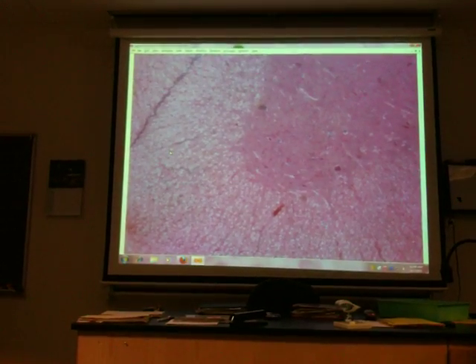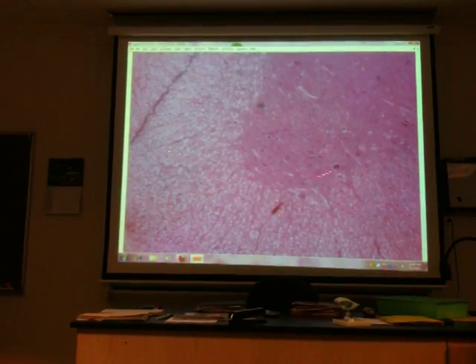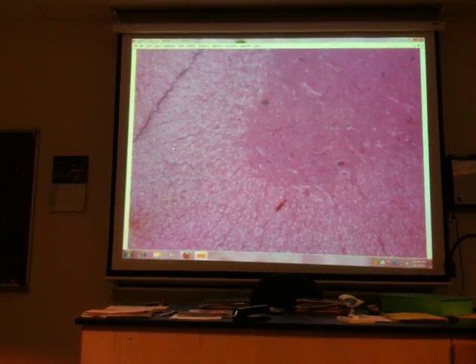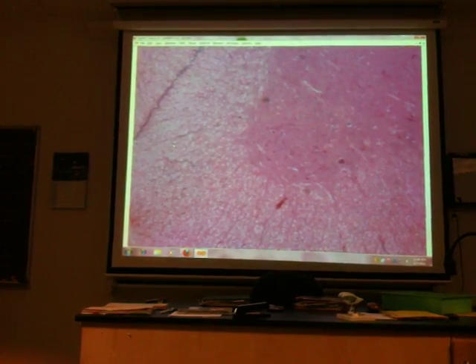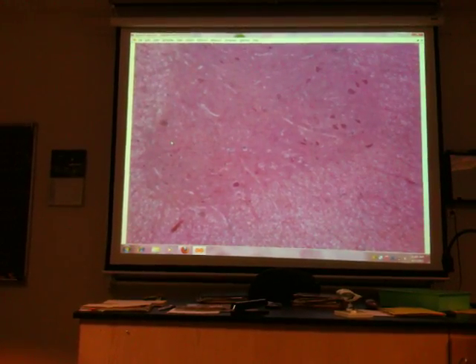Somatic motor. Is Carrie right? Somatic motor neurons, somatic motor control from this ventral or anterior gray horn. Anterior front, driving the car, motor. Okay. Let's follow the side of that gray horn up.